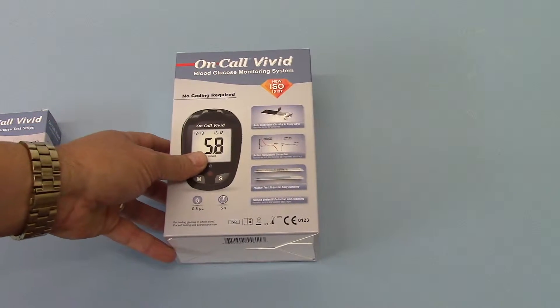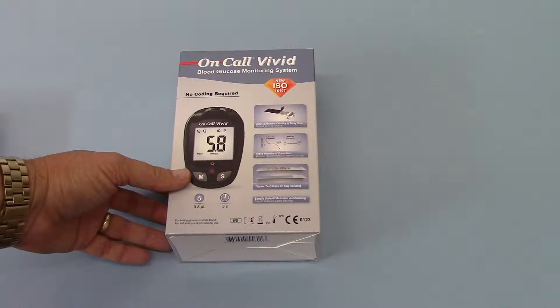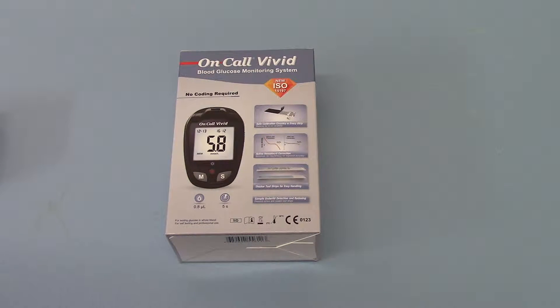The starter kit as you order it online is just this box here that we're showing you. The features of the OnCall Vivid which make it stand out from other glucose meters on the market are multifold.